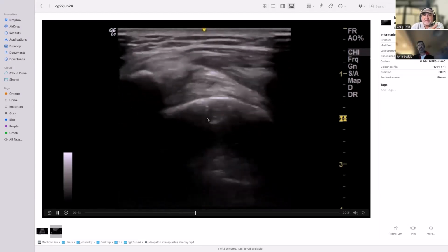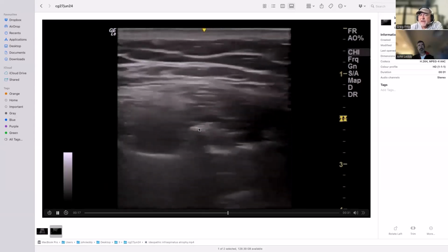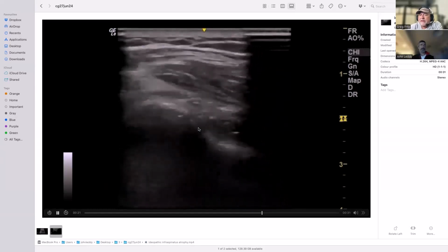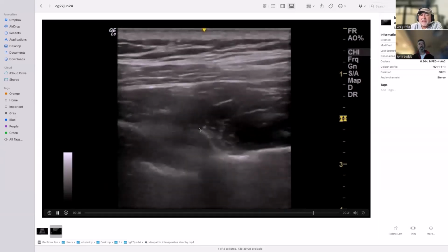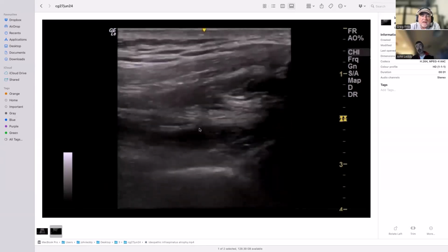So let's apply this clinically. Where do you go in your mind? Are you saying this is neurogenic? If you see a quality tendon and that happening, or is this just... Yep. Basically, the vast majority of times you see it, it's secondary to a tear.